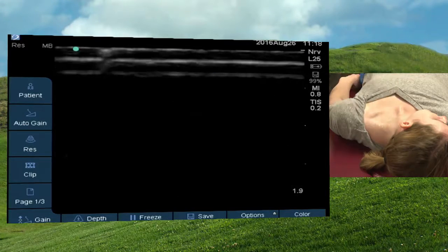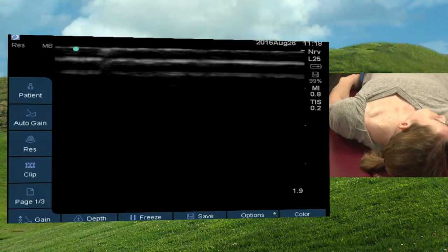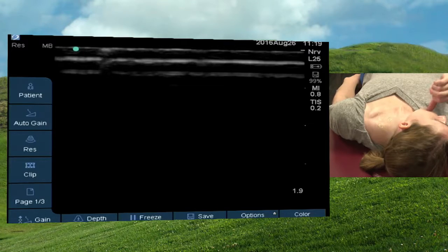So the question is, for those of you out on the interwebs, if you're putting in an external jugular venous catheter as like an IV stick, do you need to position the patient a certain way, such as in Trendelenburg? I think the official answer is no. I think officially you don't even have to put a patient in Trendelenburg for a central line. I almost always do, because putting patients in Trendelenburg is going to increase the venous pressure and help that vein to distend. So putting someone in Trendelenburg or lifting their legs up is a great way to help find those veins, kind of help search for them.